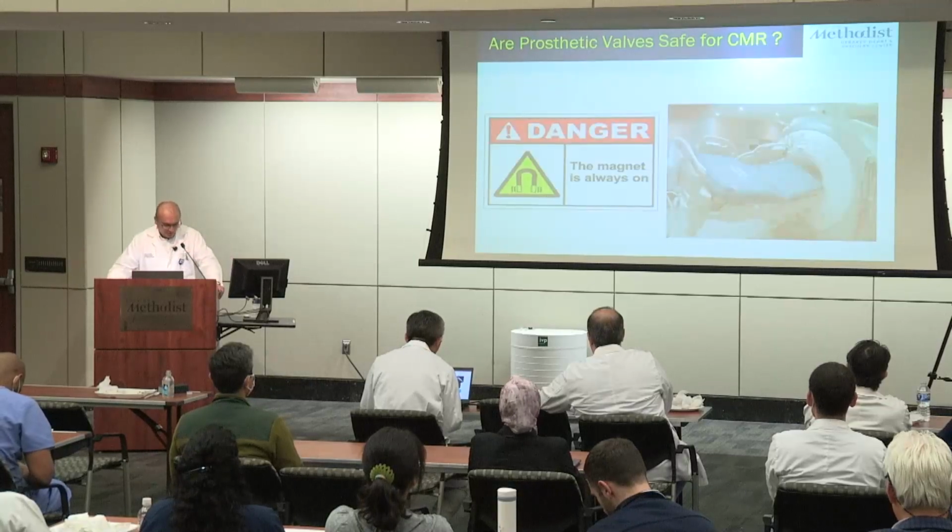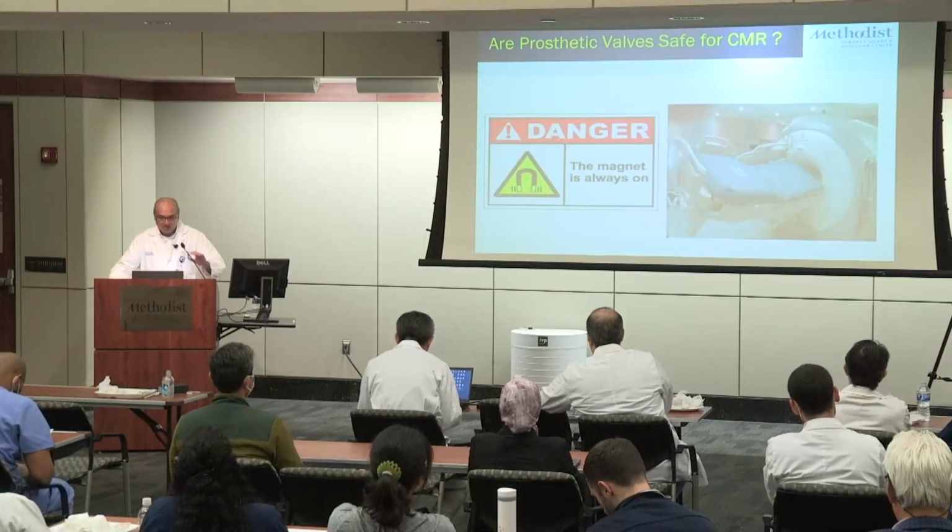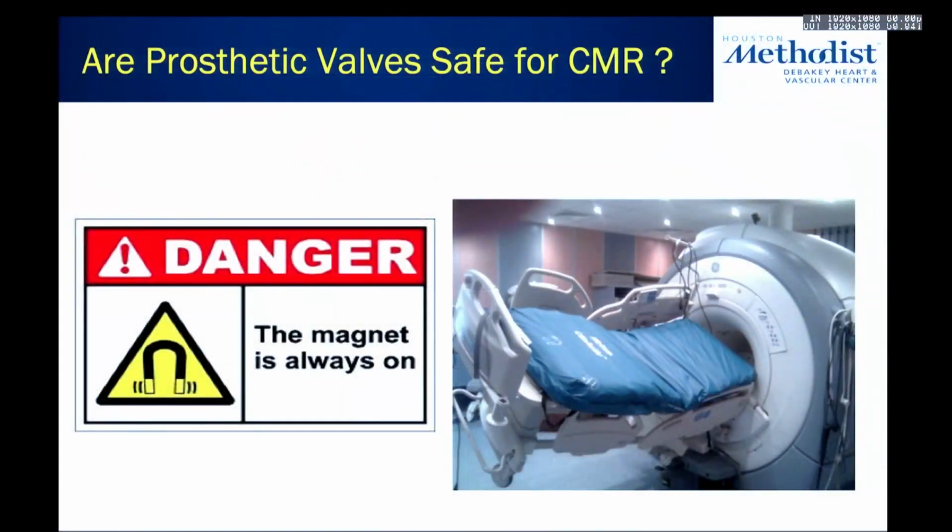So, the first question I think people always ask is, are prosthetic valves safe for MRI? So I think I want to get that out of the way. So this is not a prosthetic valve. This is a hospital bed, and that's not safe, okay?